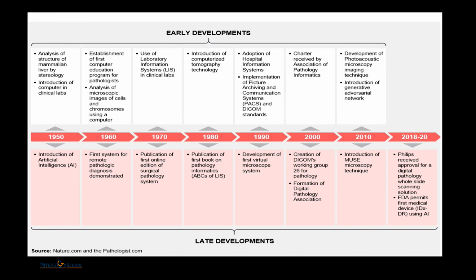Digital pathology is not a new concept. It has been present for roughly 40 to 50 years. It started with the use of computers in hospitals and in pathology. In 1986, telepathology was introduced for the first time. Roughly in 2000, the Digital Pathology Association was formed.